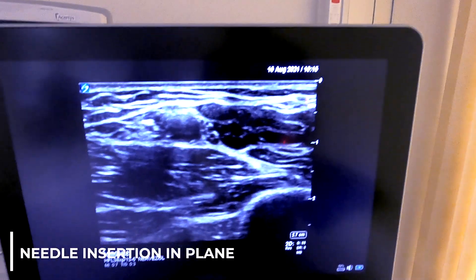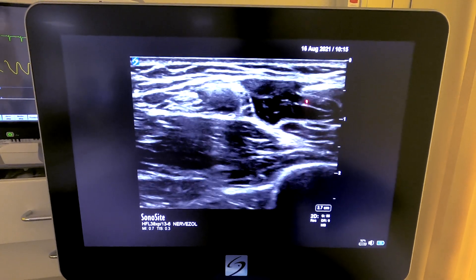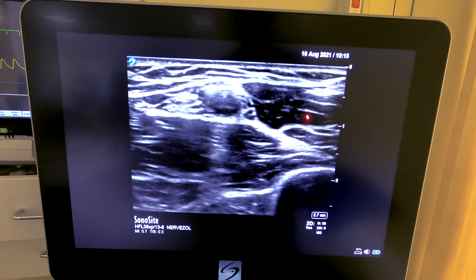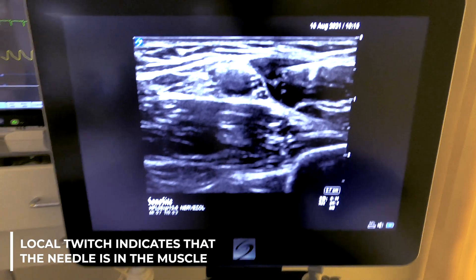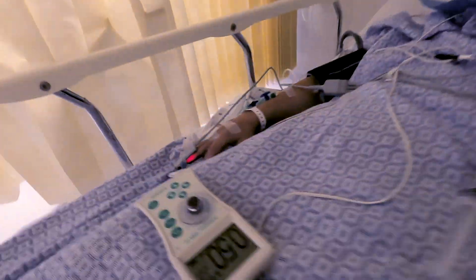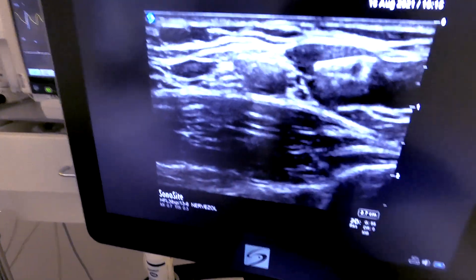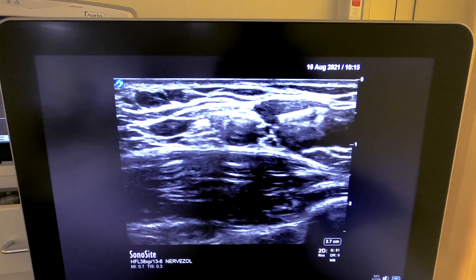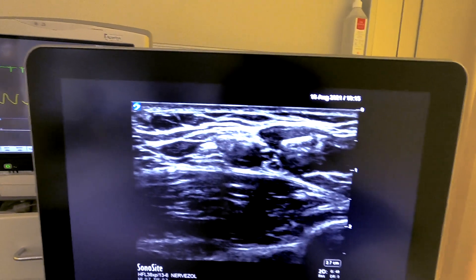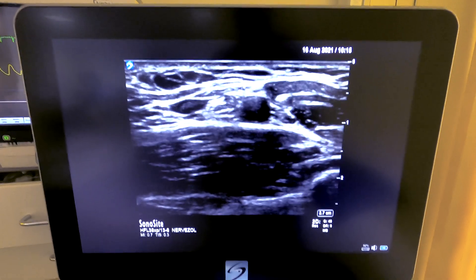The needle is entering through the superficial fascia and we're now in the biceps muscle. We're getting pulsations of the muscle because we are using a nerve stimulator connected to the needle at a current of 0.5 milliamps as a monitoring tool. These local twitches inside the biceps simply tell us we're not in the position where we want to be, and the stimulator gives us the position of the needle just in case we did not see it visually.